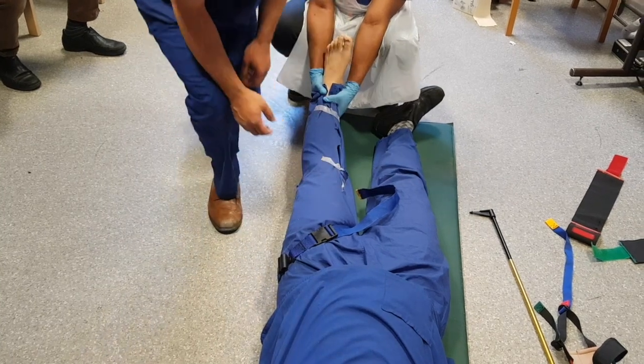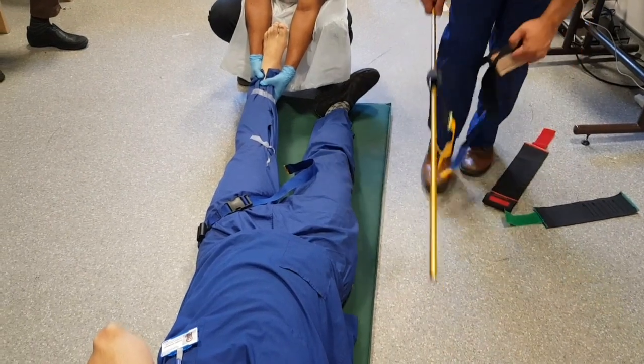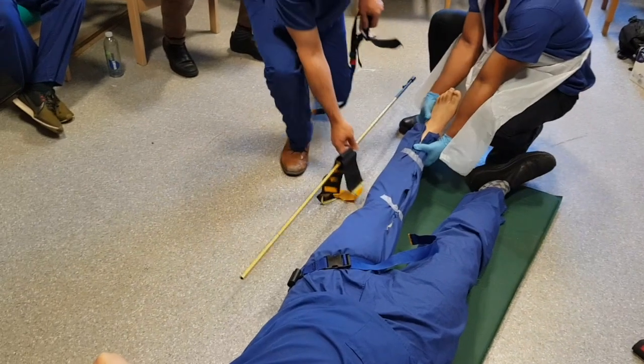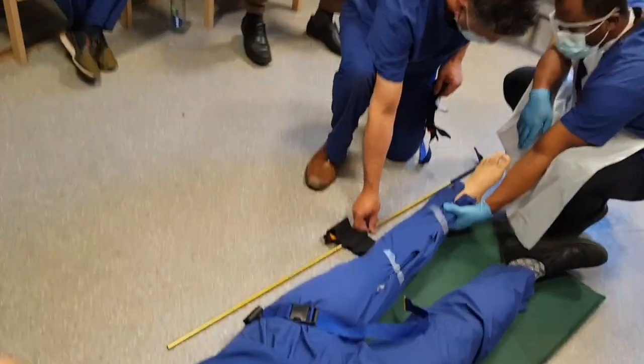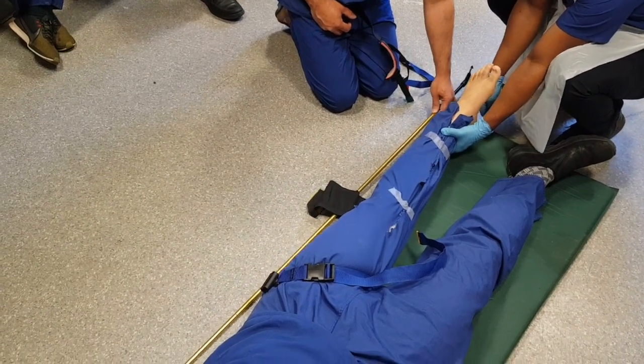That's as proximal as it's going to go. Now I want to measure out the pole and apply the ankle strap. I want the pole to be a lot longer than his leg — if you get the black line about the level of the foot, that's probably enough.